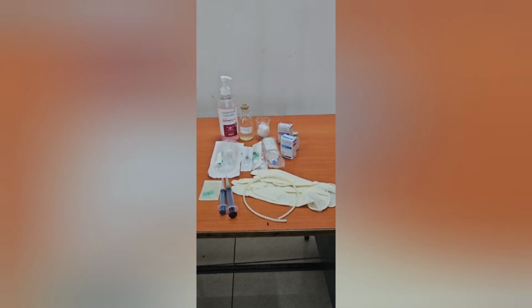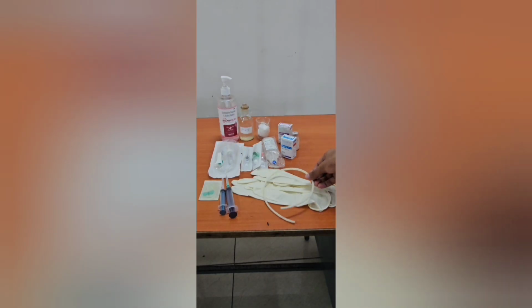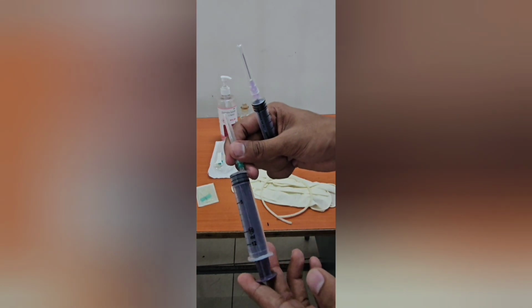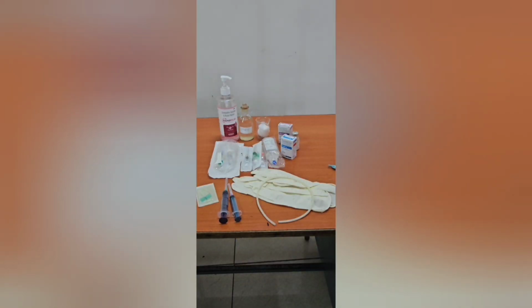The materials required are as follows: an alcohol-based hand rub, spirit, cotton ball, gloves. In IV route, we'll be using a tourniquet to be able to access the vein better. IV route is split into two types. First is the IV bolus, for which we'll be using two types of syringes, a 5 ml syringe and a 10 ml syringe. Next is IV infusion, for which we'll be using solutions like Dextrose or Pantoprazole.